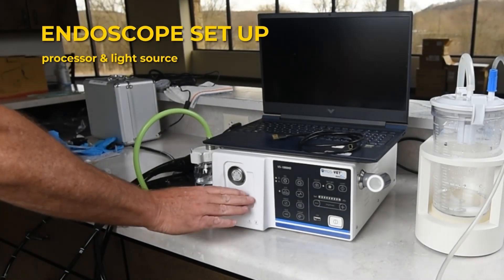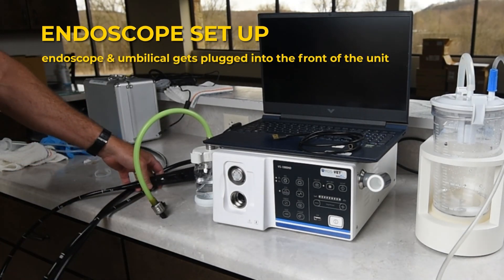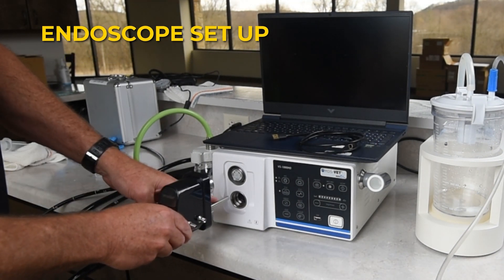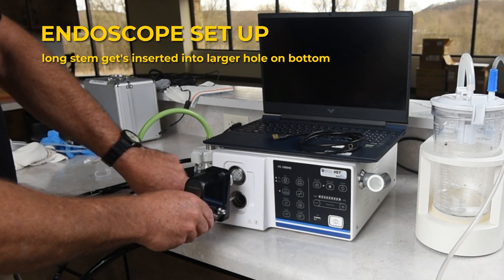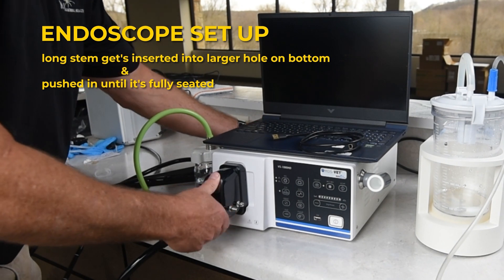This is the processor and light source. The endoscope, with the umbilical, gets plugged into the front of the unit. The long stem gets inserted into the larger hole on the bottom, and pushed in until it's fully seated.